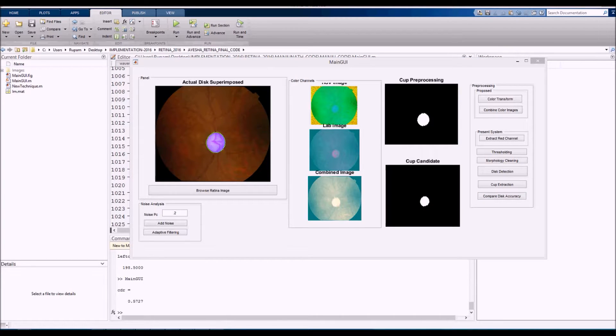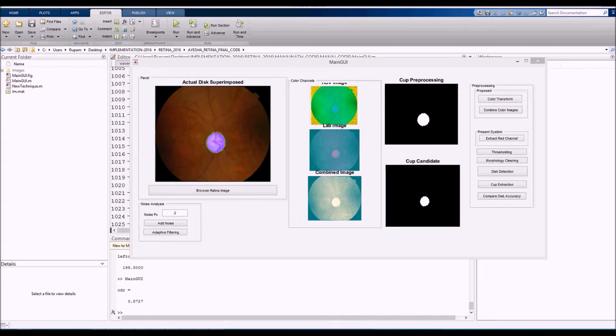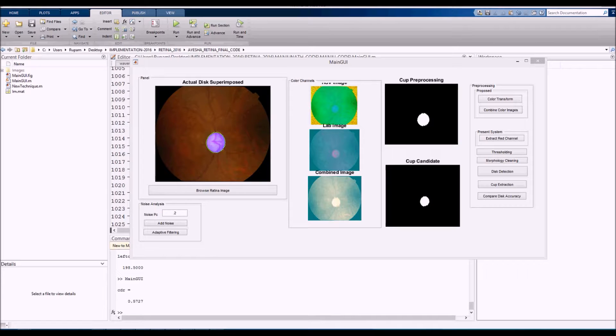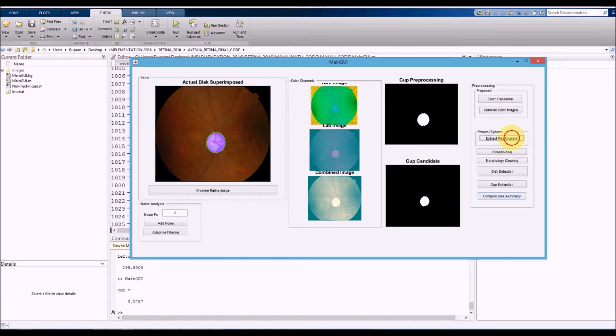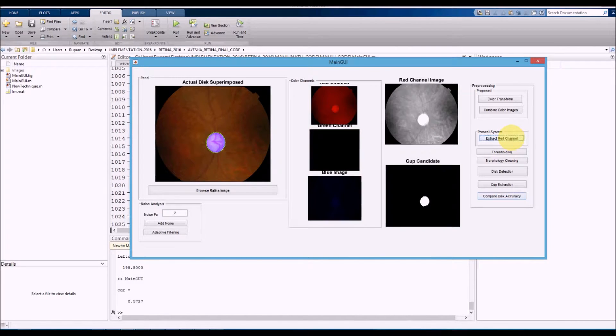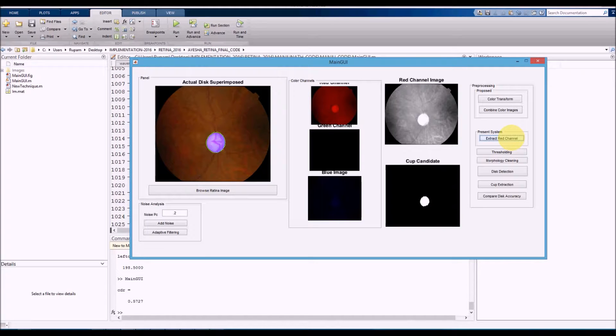The accuracy that we get, we want to compare it to the present system. The present system is the color channel-based method where we use the RGB color and extract the disk based on the red channel. Extract red channel. Once we extract the red channel, the red channel image is highlighted.